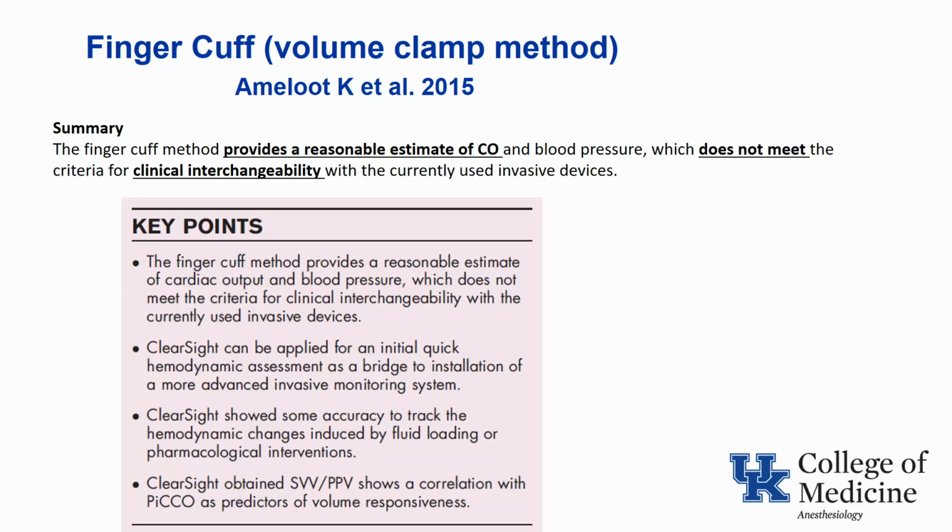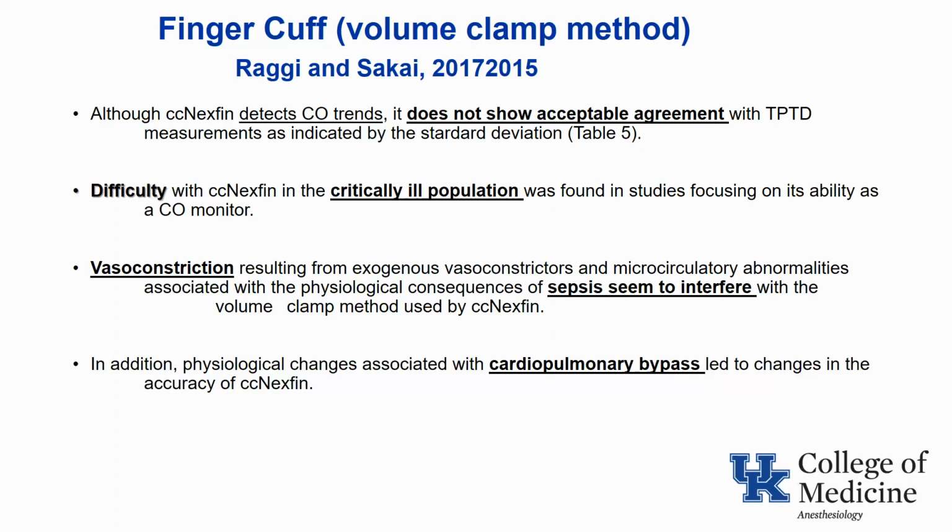And this review article, which suggests that it is reasonably useful in healthy patients, but doesn't meet the criteria for clinical interchangeability. The same conclusions were reached by this other review paper from 2017.